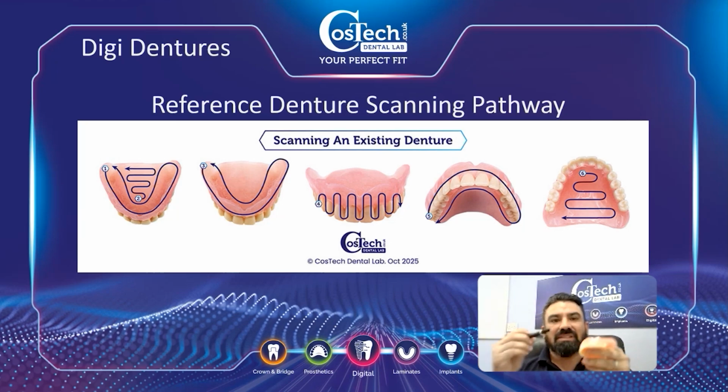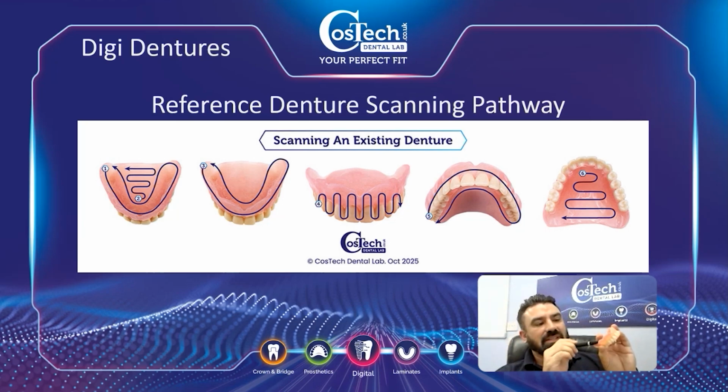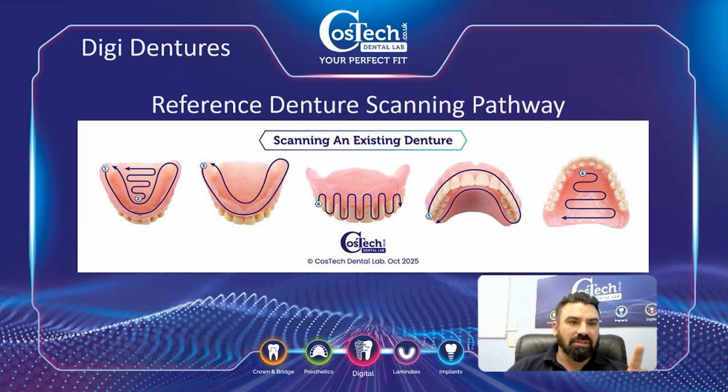When you're scanning the fit surface and coming over the apex, you need to make sure that you've got a good solid scan, because again you might end up with stitching errors where it's trying to take that plane and stitch it together. The second icon there shows you how important it is to get a good reference point. If the scanner gets lost, you go back right onto that peak there. Then you put the denture back in the patient's mouth and get them to bite, and you do the actual bite scan using that. We take the various different scans, and in ExoCAD we can recreate the bite.